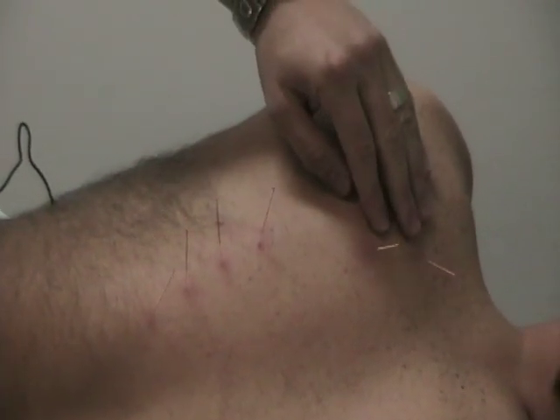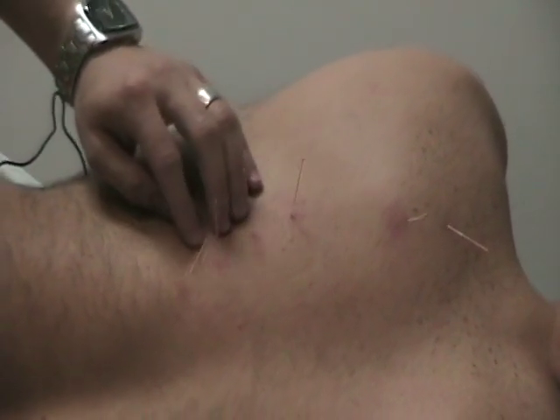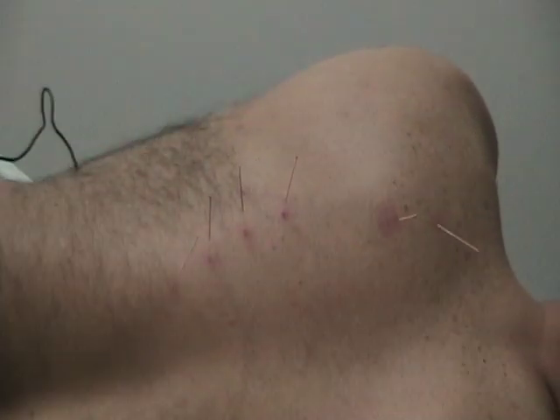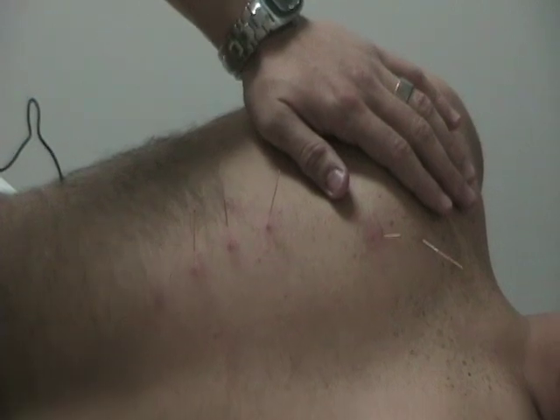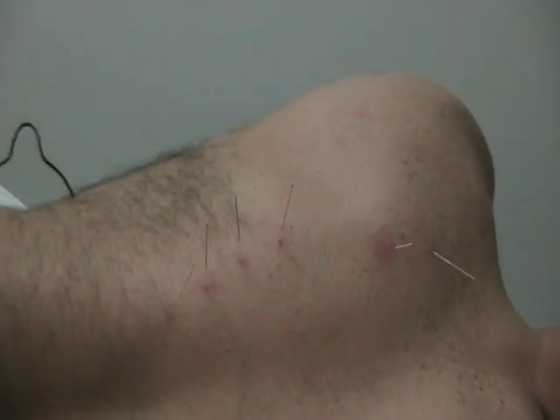I have two needles in the rhomboids major and minor, and here I have a line of needles in the inferior trapezius. I'm going to stimulate these motor points in order to get the nervous system active in that area.